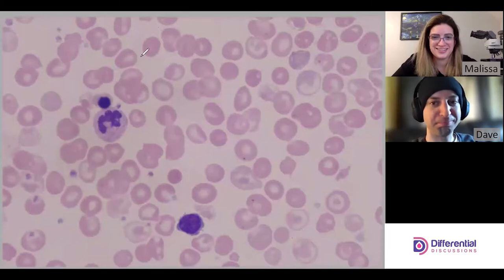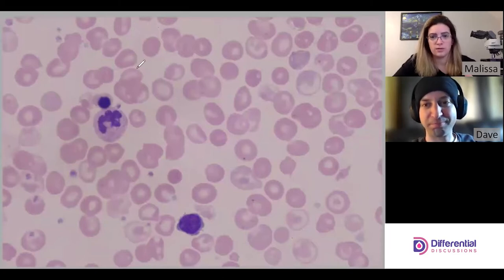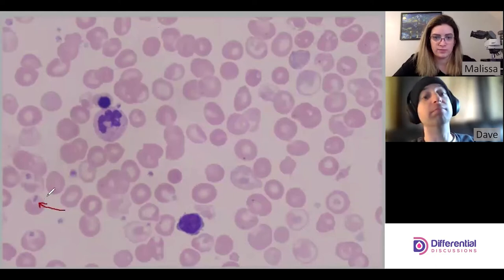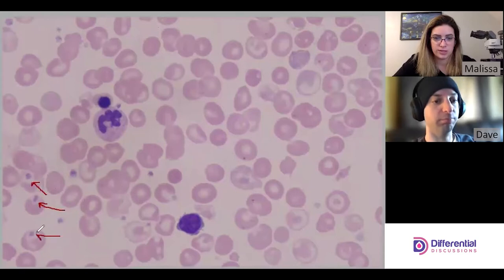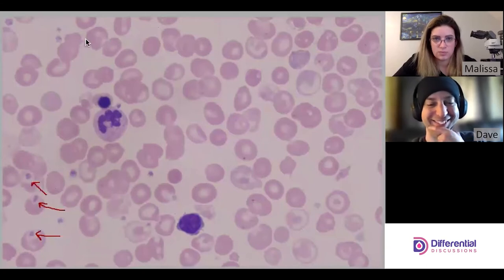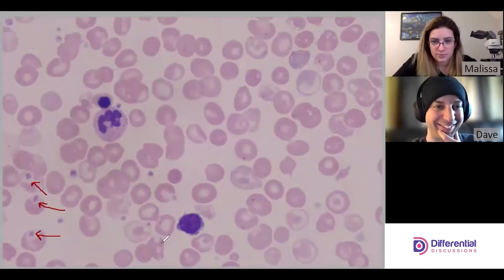I want to point out inclusions versus platelets because there are so many here. This is a platelet, this is a platelet, this is a platelet — look at how many platelets we have on red cells.